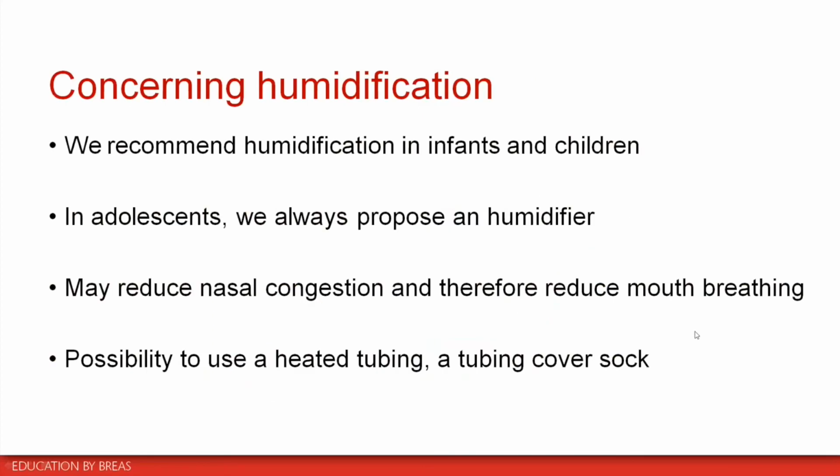And concerning humidification, there is, I think, no rules, but usually we recommend humidification systematically in infants and children. This is a comfort, but it may be very important to make the tolerance, acceptability of the treatment improved for infants and children, to avoid the dryness of the nose and the mouth. It's very difficult to know for infants or children that are not able to speak if they are comfortable with this level of humidification.